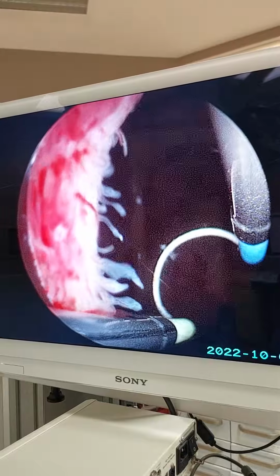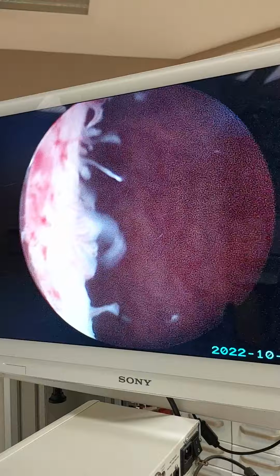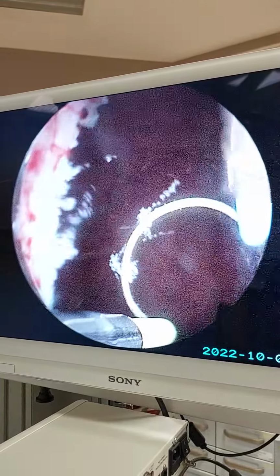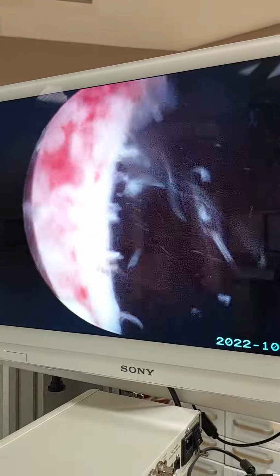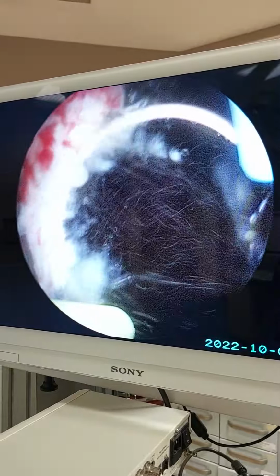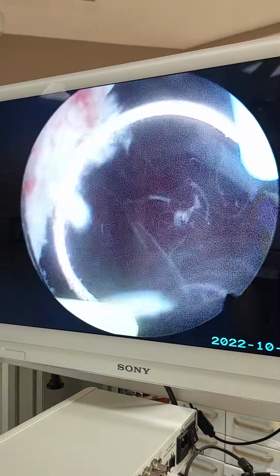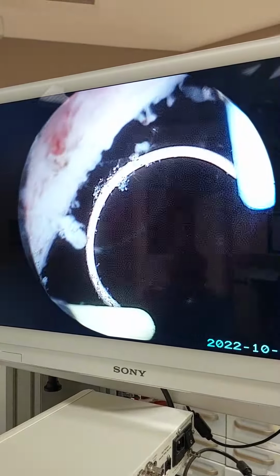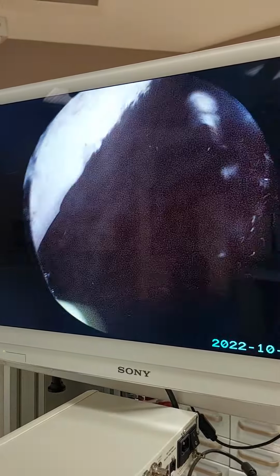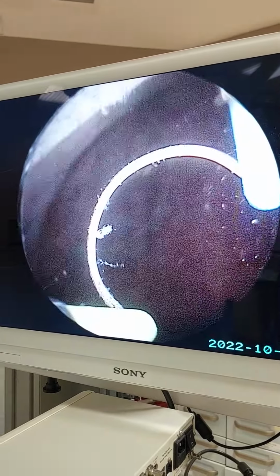These are all formed because of infection, and these must be cleaned. They are full of infection. When I fulgurate, you see some infected particles coming out. It's more abundant in the right side, which was expected actually. The patient has more symptoms in her right side inguinal area, radiating to the kidney.